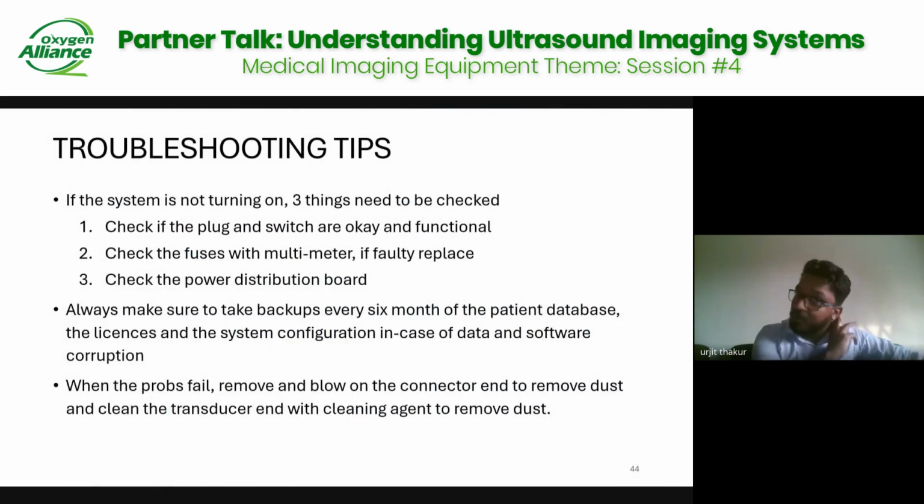Okay, now finally, troubleshooting tips. This is what I generally do. When you get calls, maybe 60% of the time the machine is not turning on. What you need to do is first check if the plug and the switch are okay and functional. You can also check if there's power coming to the plug. Then you can check the fuses within the system, as a power surge might have blown one of the fuses. And the last is to check the power distribution board within the ultrasound itself.